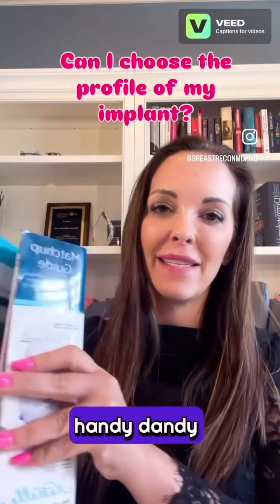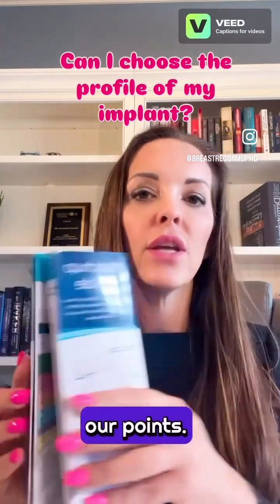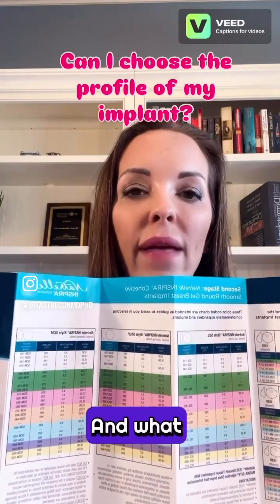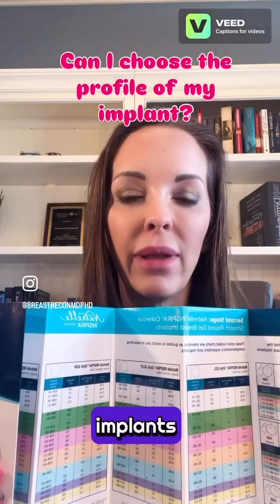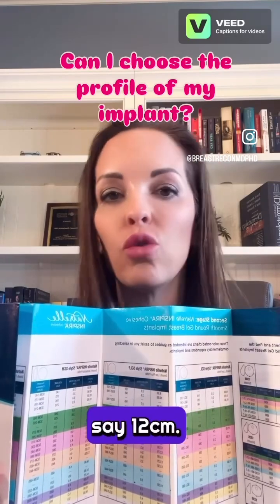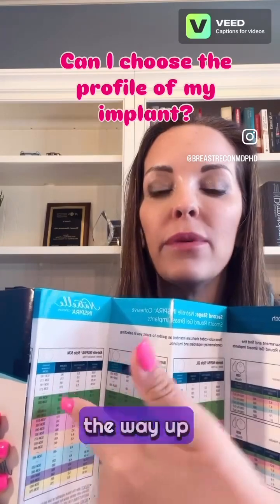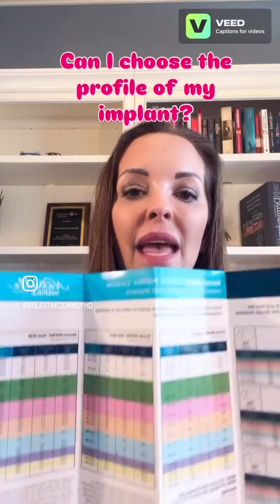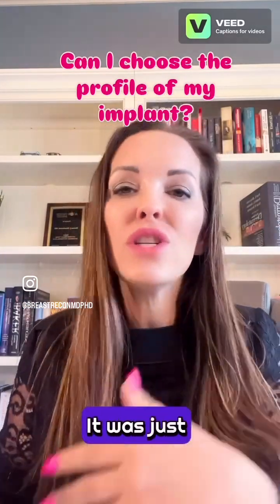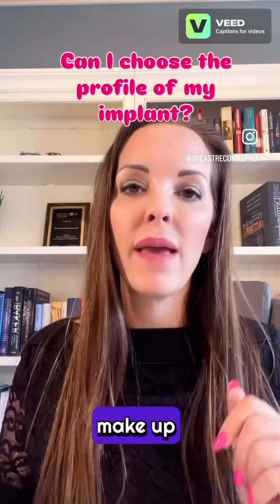This is my handy dandy Allergan size guide, and I know it's backwards so you can't see it, but it's going to illustrate our points. If you open it up, you can see that there's different colors, green to yellow. And what this does is it is breaking down implants based on their base width. And so it's showing for a different base width, say 12 centimeters, you can go from a low profile implant all the way up to an extra full profile implant. And you can see they just broke it down so that it fits nicely in a table. It was just random breaking down of implant sizes for each breast width to make up different profiles.